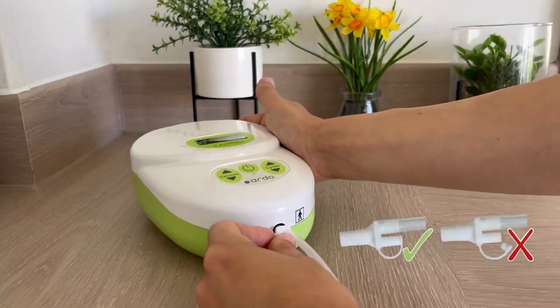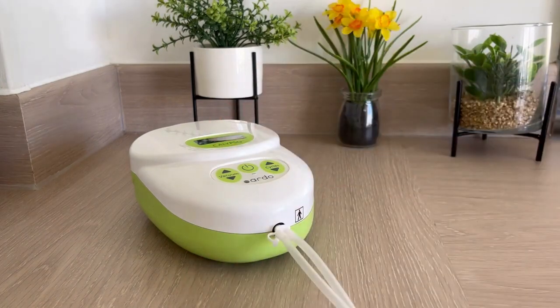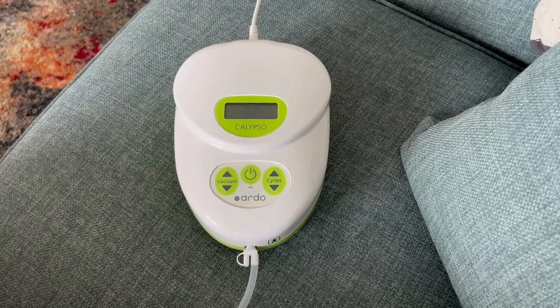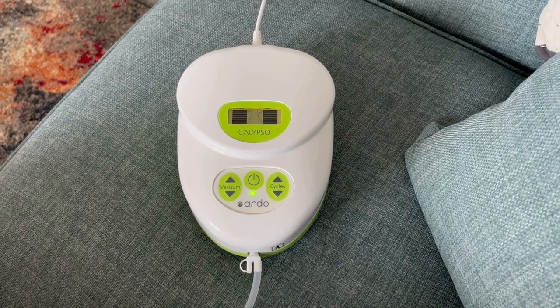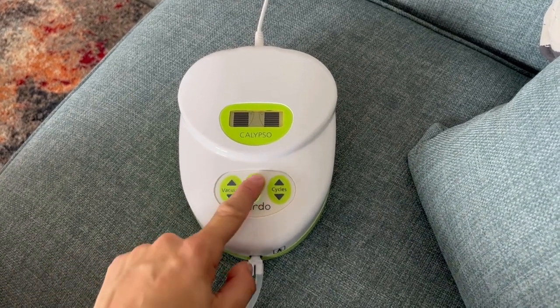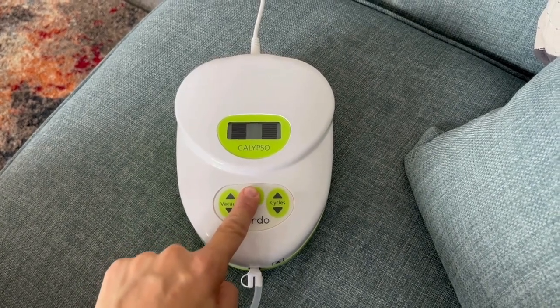If we are single pumping we need to close this cap, and if we are double pumping we need to assemble another pump set and then connect the other tube to the tube connector. If the tube gets kinked at any point this can trap air and the pump will cut out. The pump will go into error and you need to turn the pump off, then release the tubing and turn the pump on again to continue pumping.